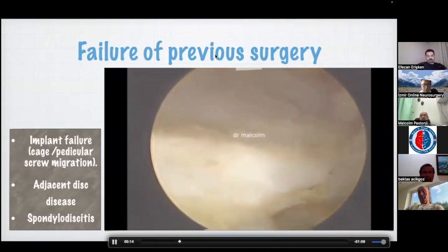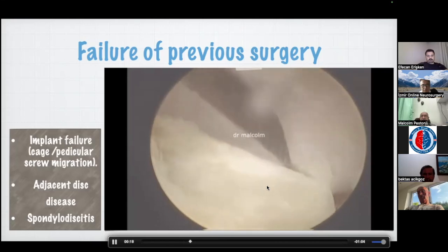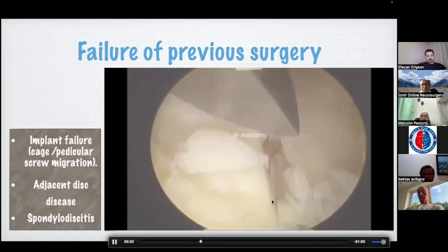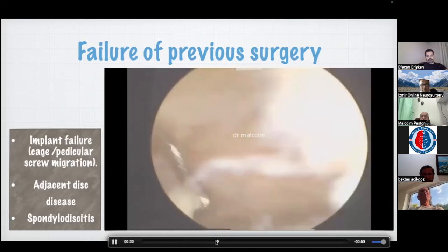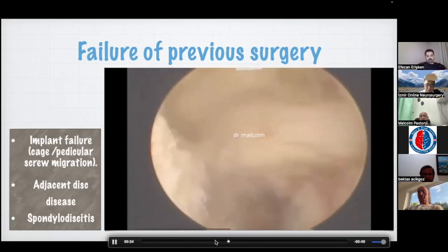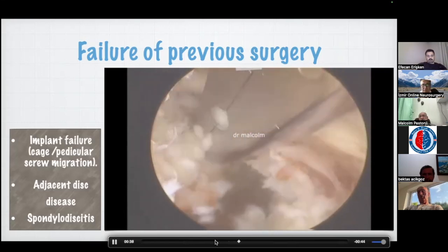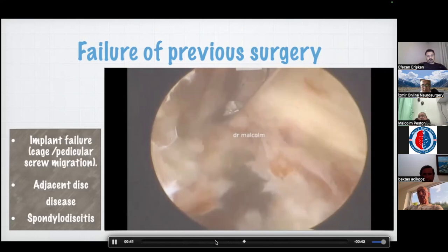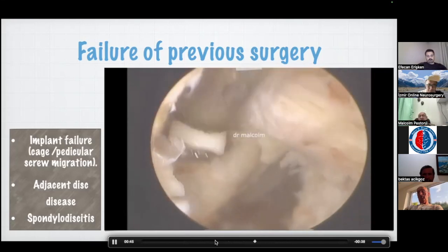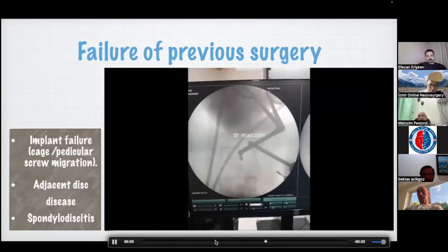You can see that I've removed part of the IAP from above. I'm fracturing through the lamina now. I'm cutting away the bone. I'm exposing the dural surface. I'm going down for the down migrated fragment again. I've changed my portals. My scope is in my other hand now, so that I'm inclined to go down on the vertebral body. And I can peacefully go down there, remove all the dirty, mucky tissue, burn everything over there.